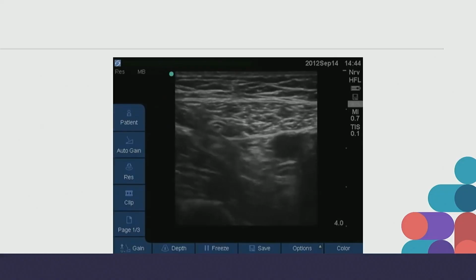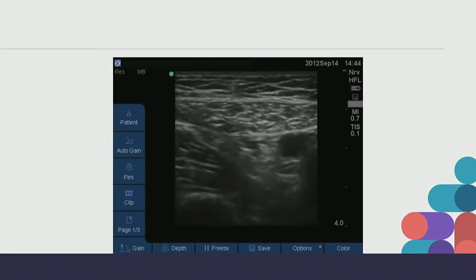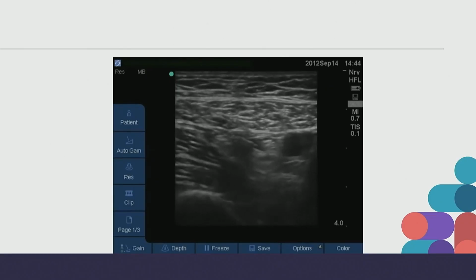So you're popping under the saphenous nerve, getting in the adductor canal here, popping through one more membrane called the vastoadductor membrane to get that saphenous, but you do have some retrograde extravasation of local anesthetic to get you that nerve to vastus medialis as well. If I'm doing just a foot and ankle procedure, I don't need to worry about that. I just need the saphenous nerve. But if I'm doing a total knee arthroplasty, then targeting both is very important.